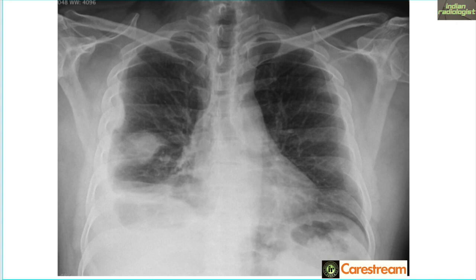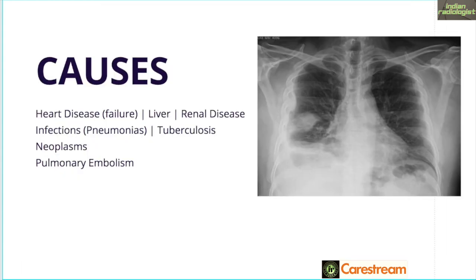Again, pretty simple. What you can see is a soft tissue density shadow seen in the right costophrenic angle, blunting the costophrenic angle and moving up to the axilla. We also see a biconvex soft tissue density shadow which is nothing but fissural effusion. The diagnosis is right-sided pleural effusion with fluid lying in the fissure as well. Causes include heart failure, liver and kidney diseases — usually transudates. Tuberculosis is a major cause, and a one-sided pleural effusion should prompt consideration of TB and pleural tapping.